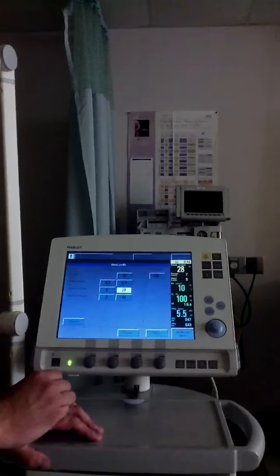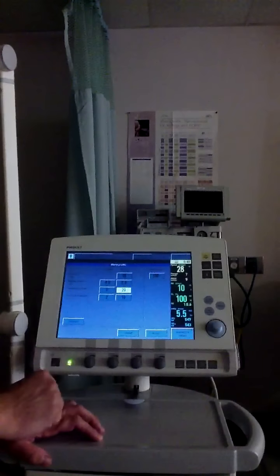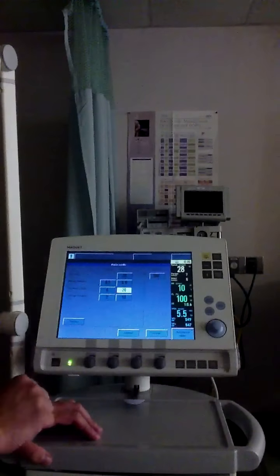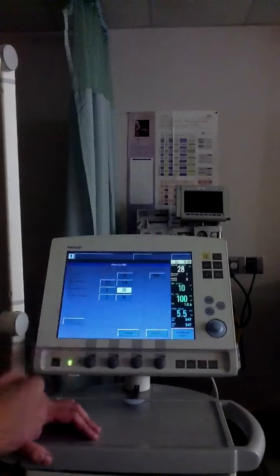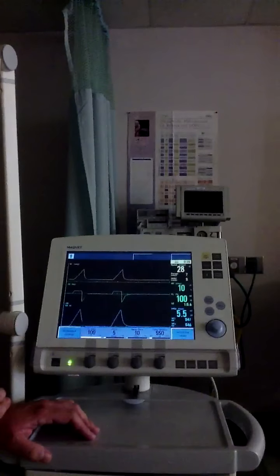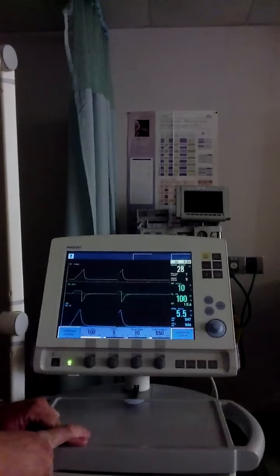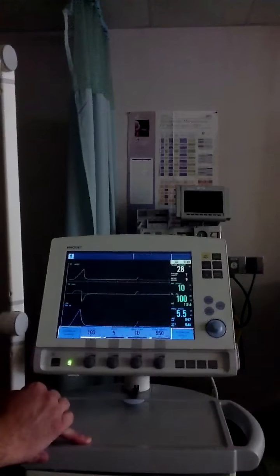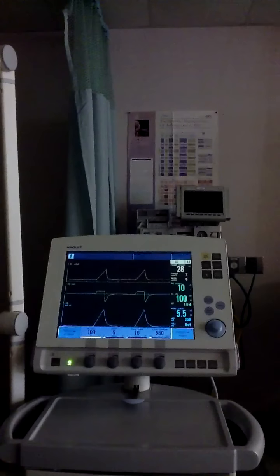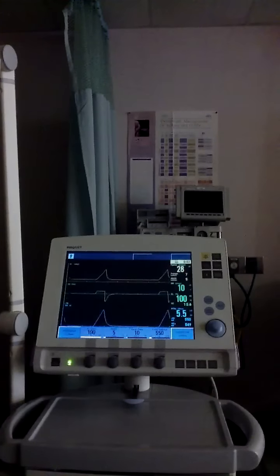The apnea parameters are pre-built into this machine — they're good to go. I would have confirmed that when I did the SST because I would have gotten an alarm. I'll go ahead and accept, then continue to monitor my patient: do a physical exam, listen to breath sounds, check vital signs. I want to get an ABG within 30 minutes, assess my pressures, and see how my patient is doing. That's the basic ventilator setup — hopefully you found that helpful and it'll help when you have to do your initiate mechanical ventilation competency in lab. Take care, guys.